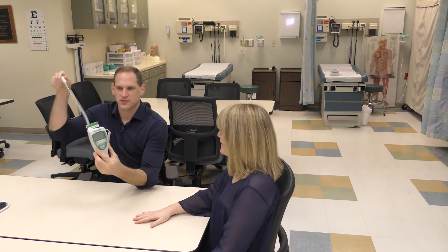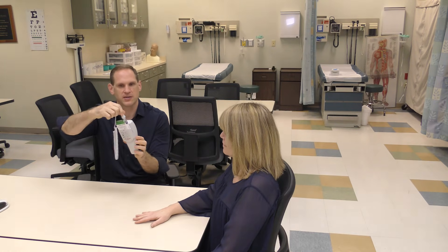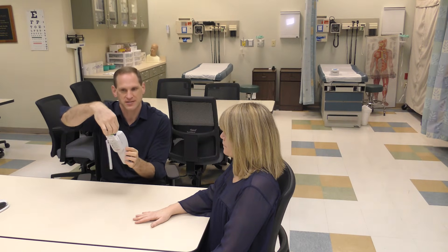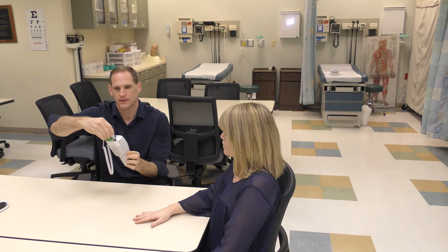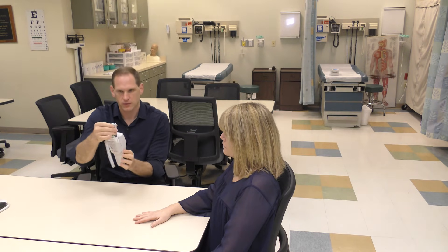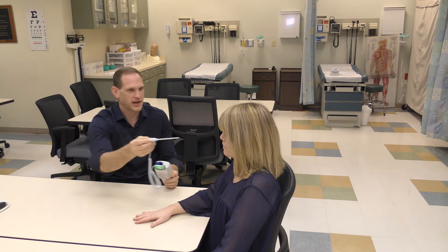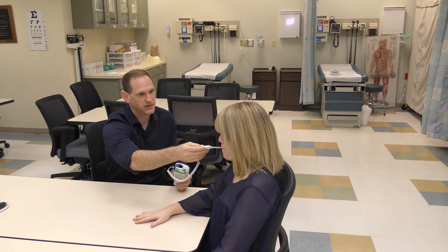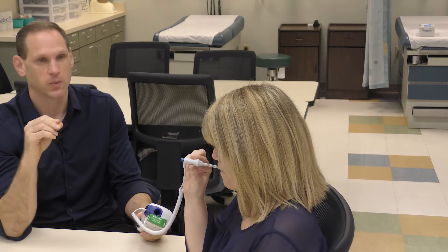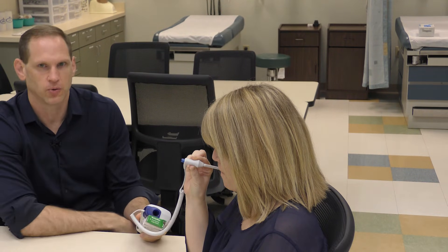You're going to lift the probe out and place one of these temperature probe covers on it. An extremely important thing: keep the probe vertical in the box — don't let it go diagonal, or the probe will get lost and you can't push the cover on. Also, hold it from the side so that the little button can be pushed out. Place it under the patient's tongue to the side; you may need to hold it, or sometimes you can ask the patient to hold it. Patients should close their lips around the probe but not bite down. If a patient can't follow those directions, you can't use an oral thermometer for them.